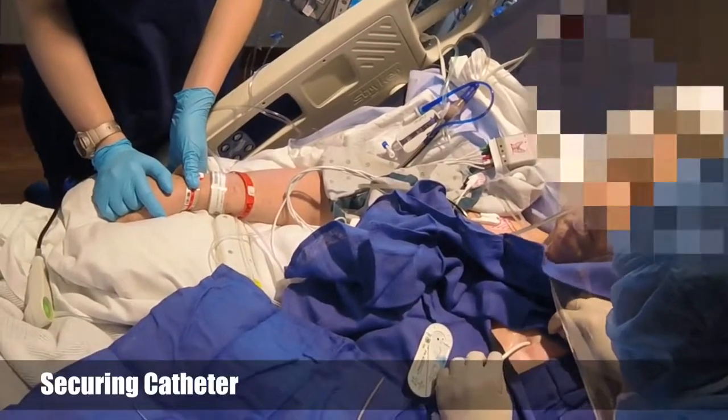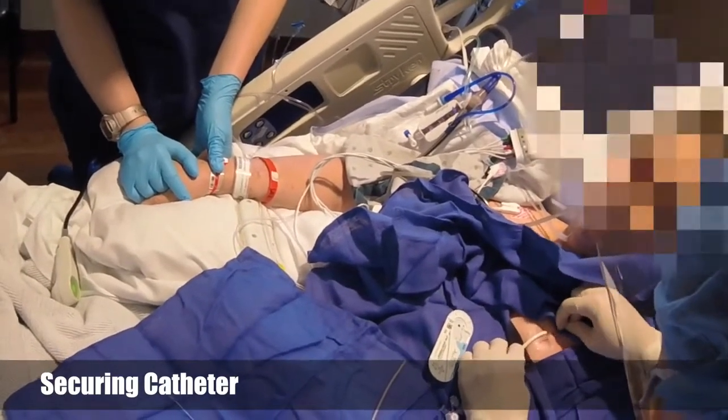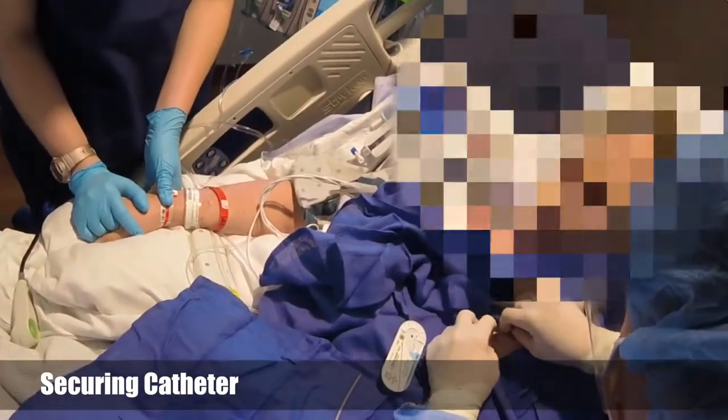We're now using a straight needle with 2/0 silk suture to make an air knot on the skin.